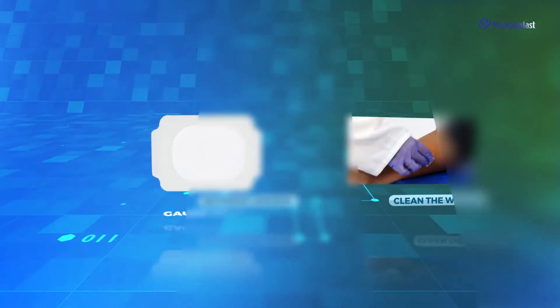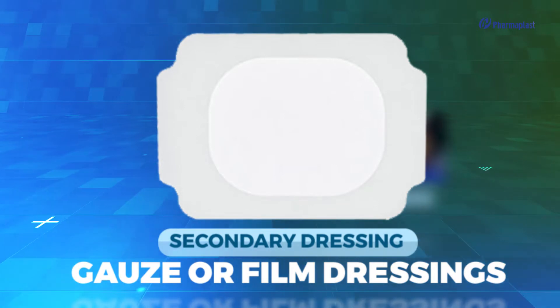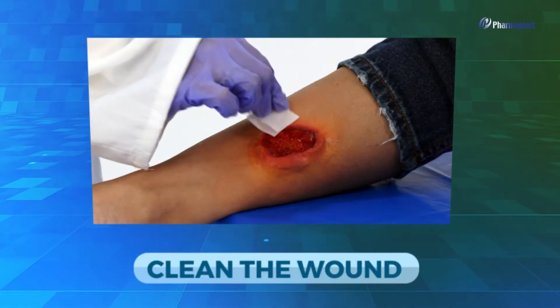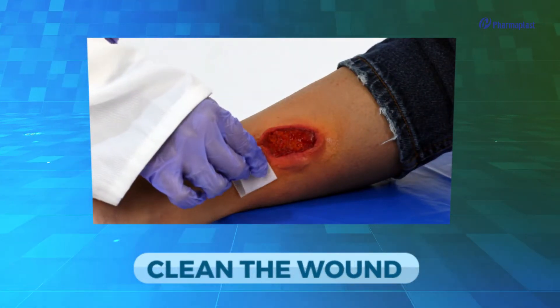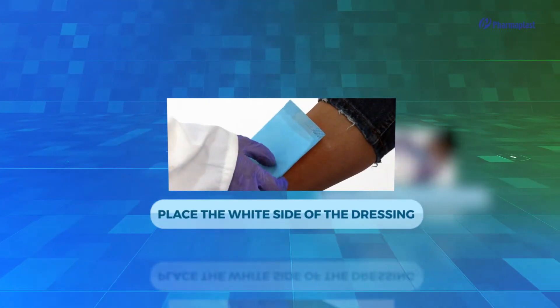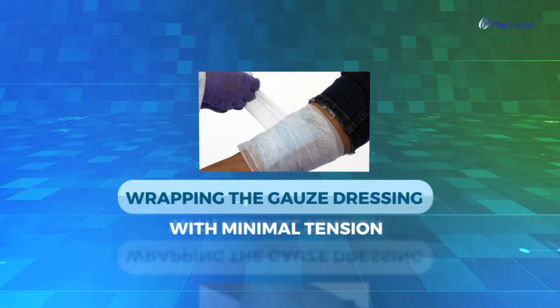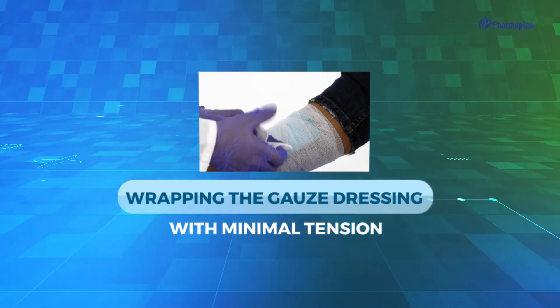To apply XORP, you will need a secondary dressing like gauze or foam dressings. First, clean the wound according to your normal procedure. Secondly, place the white side of the dressing over the wound, making sure it covers the surrounding skin by at least 2 cm.